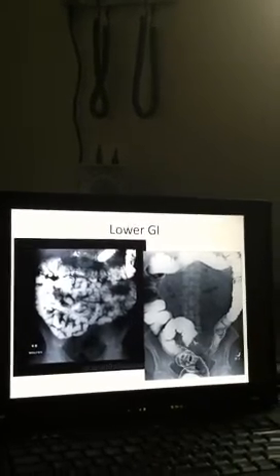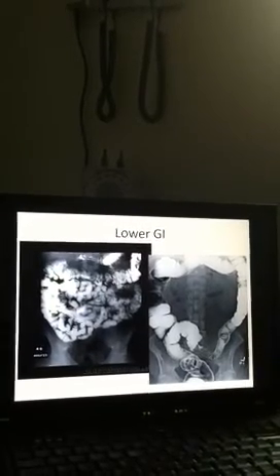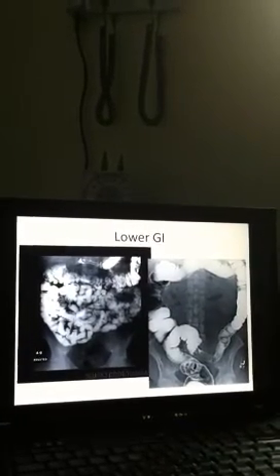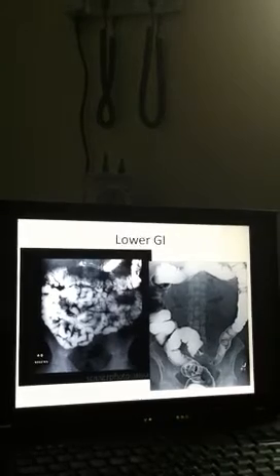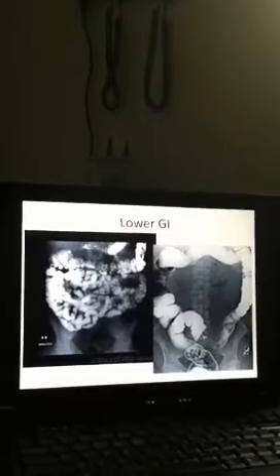Sorry, how come on the picture on the left, the barium still gets all the way through there, even though they're constipated? It takes a long time though. It's not fun. Really, really not fun. But yes, it will travel.